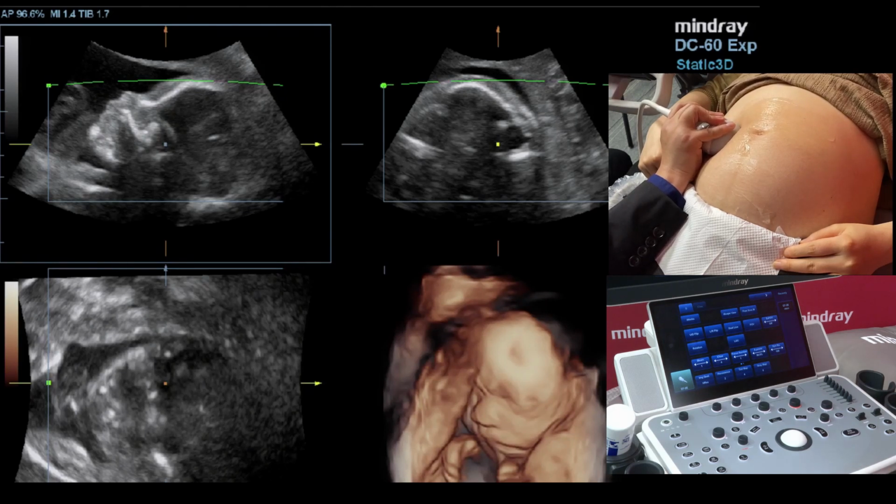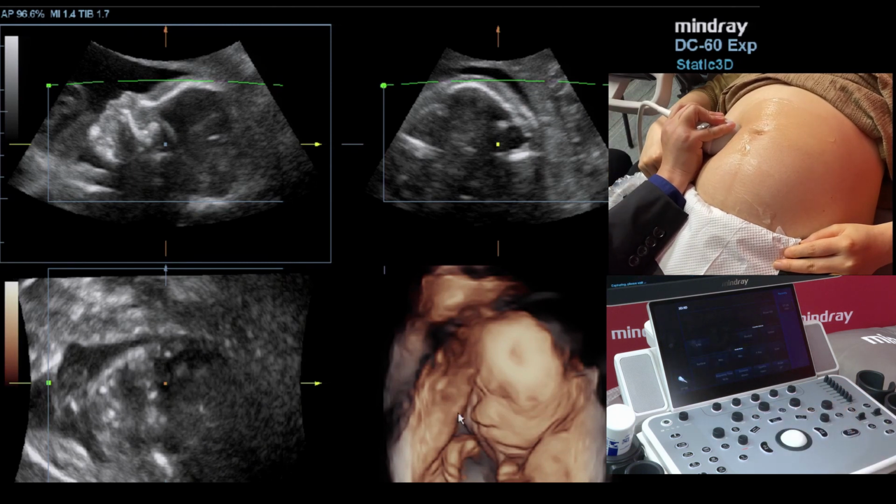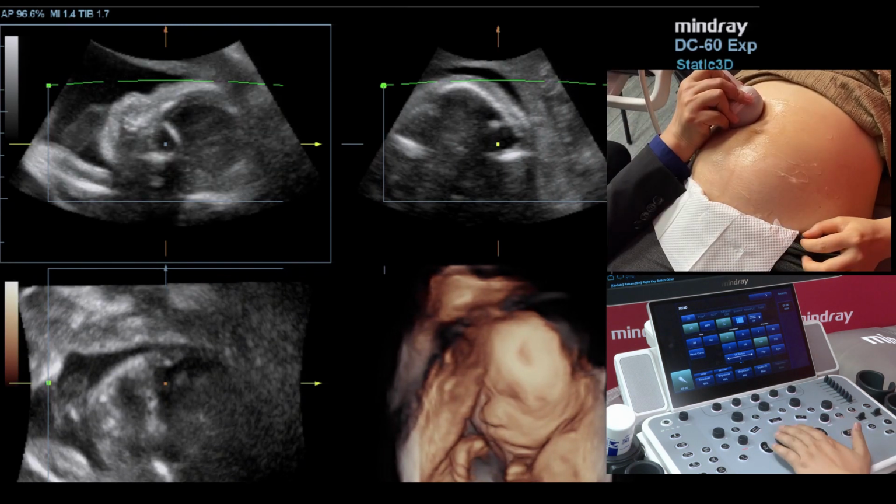So maybe you have a confusion about, I see it's much clearer in front of the fetal face. Why is there something in front of the baby's face? If you want to check what this is, you can follow these steps.